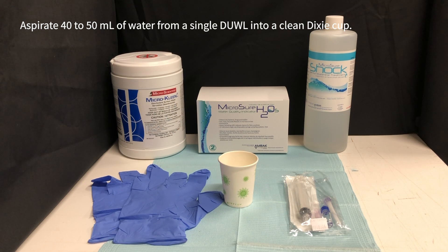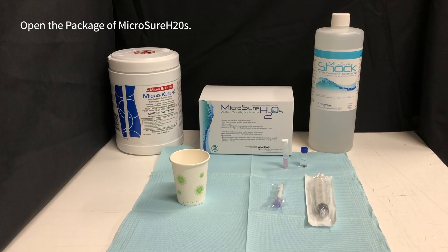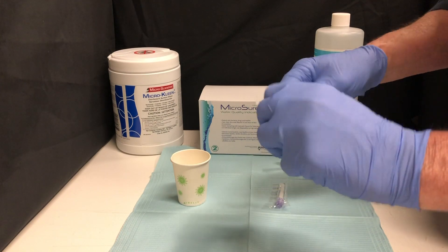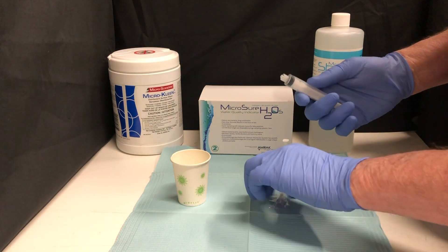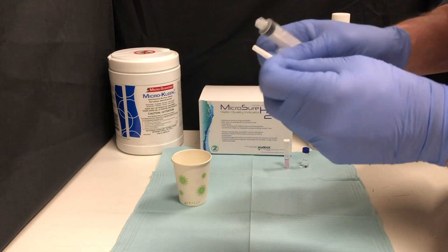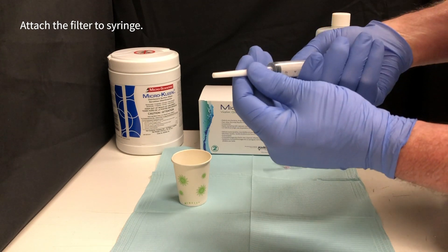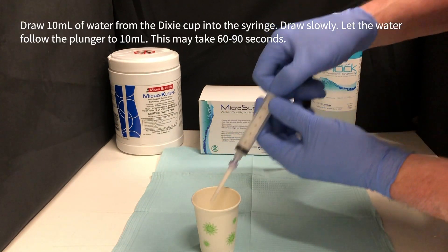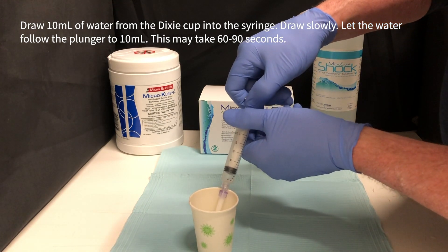Open the package of Microsure H2O, then open the individually wrapped sterile syringe and filter. Attach the filter to the syringe and draw 10 milliliters of water from the Dixie cup into the syringe. Draw slowly.